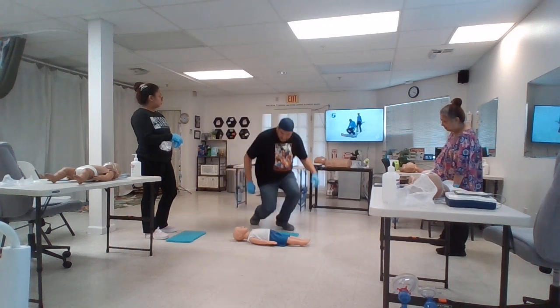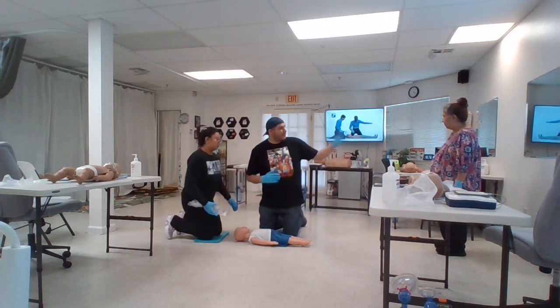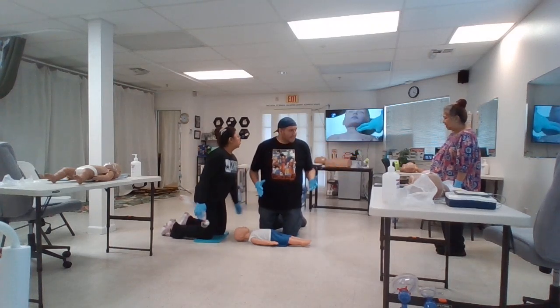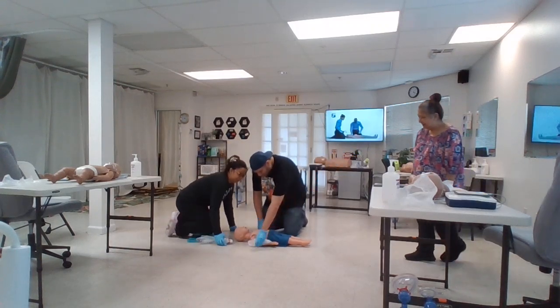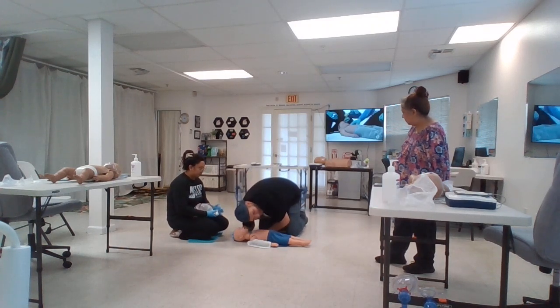Scene safe. Hey, are you okay? Hey, are you okay? Activate emergency response. Call 911. Get the AED. Come back. Check breathing. There's no breathing, no pulse.